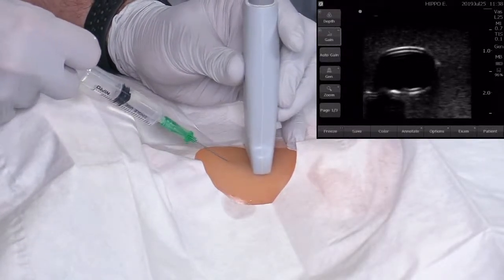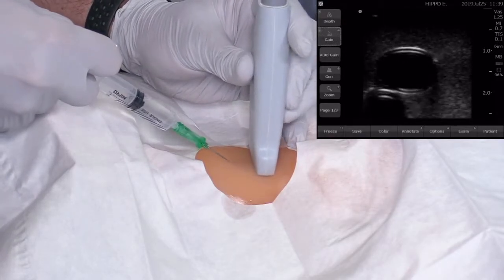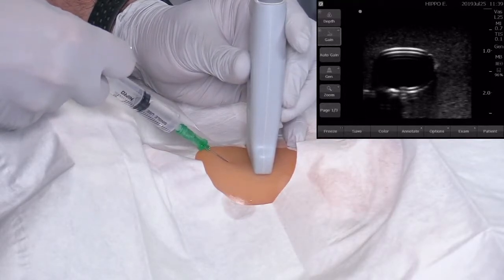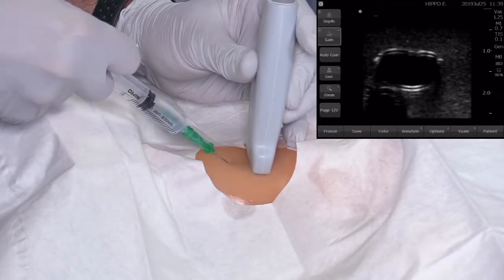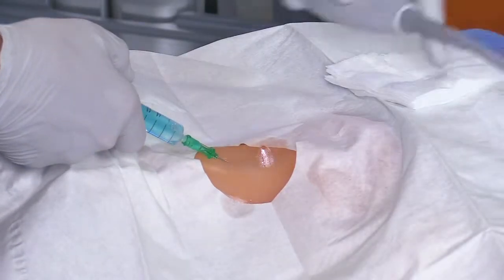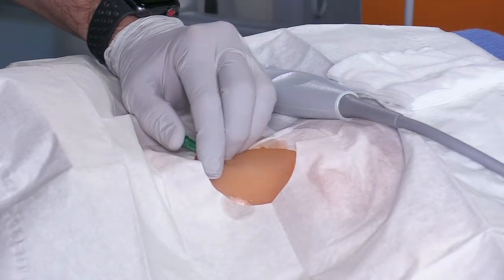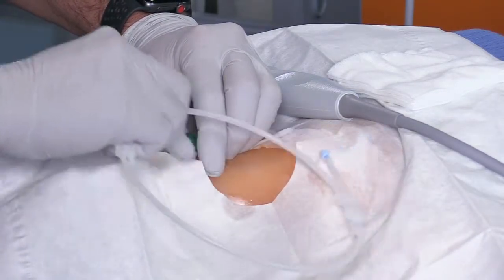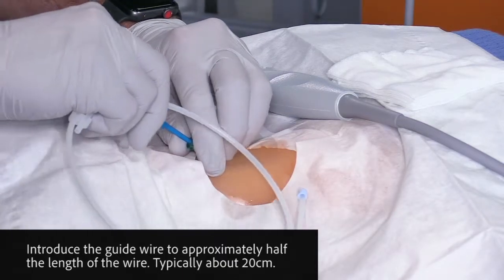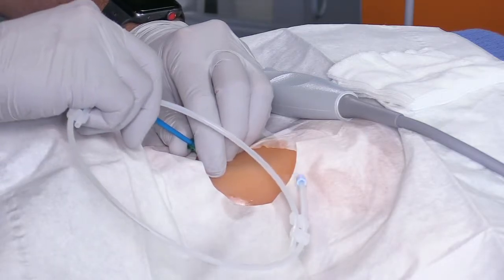Once you break the skin, pull back on your syringe so that you know you're in the vessel when you have that flash. Follow your needle until it goes into the vessel. If you're a little lateral, redirect until you're right on top of it. You can look for the tip, and as you enter it, you'll see you're in the vein — you can see the blue blood. That's the vein. If it were red, it would be the carotid artery. Now that you're in, stabilize your needle, remove the syringe, and cap that needle so you don't introduce any air.